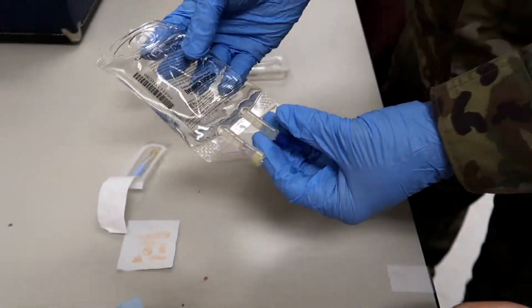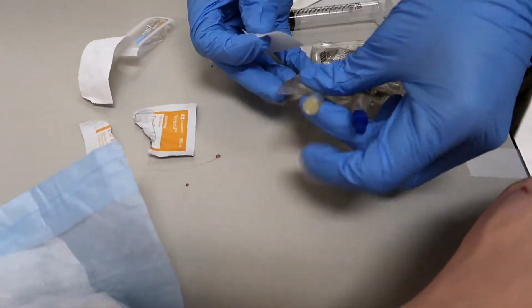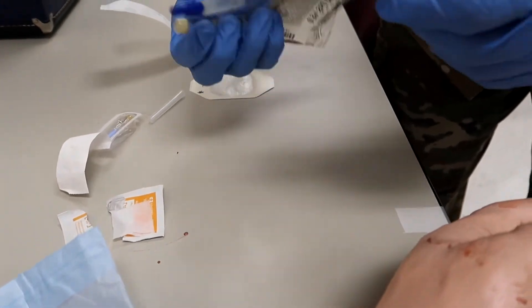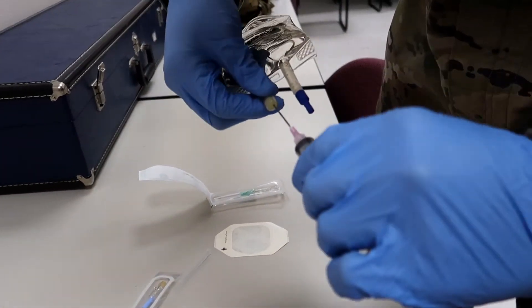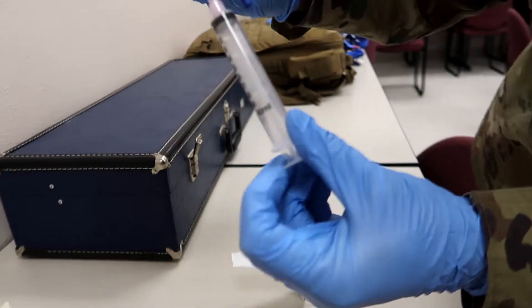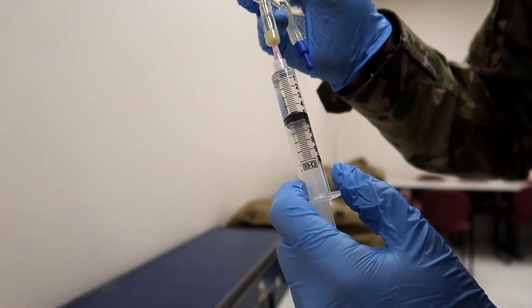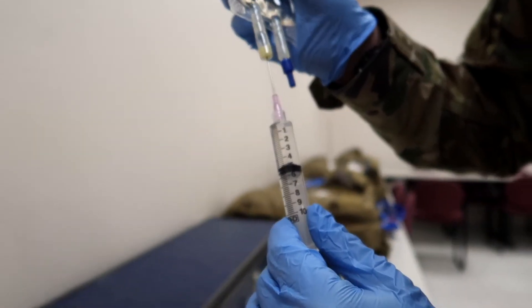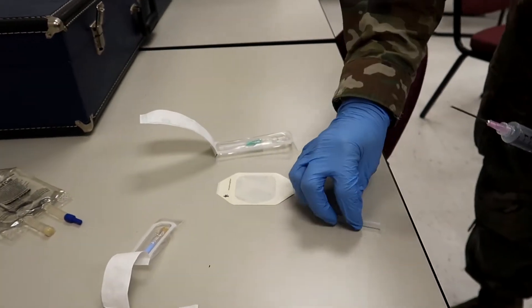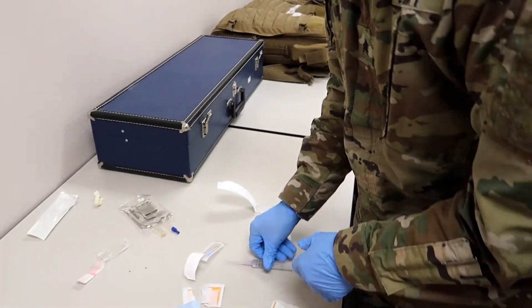He's going to go ahead and draw his saline solution. We have this little hub — come in here, wipe the sight, grab the bag and the needle. Make sure not to stick yourself. Nice and slow — needle's in. Turn it upside down, start pulling, and now he's going to draw 5 mLs. Retract the needle — make sure not to stick yourself again — then you cap it. It's going to be north to south: put the cap on the edge and just pick it up that way, so you don't touch it. That's for safety.